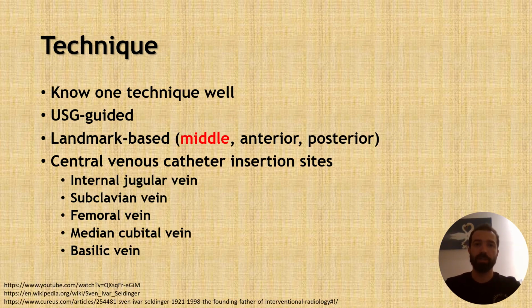Moving on to the technique, it is practical to know one technique in full detail. Nowadays it is performed using ultrasound in most places. However, it is also necessary to know landmark-based techniques. This might appear as an exam question for you or save your day in a resource-limited environment.